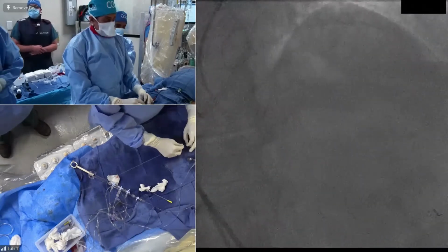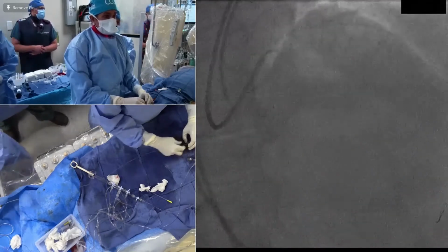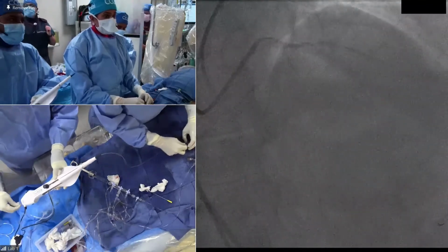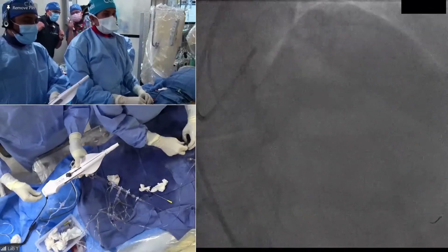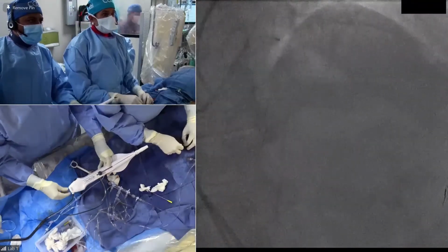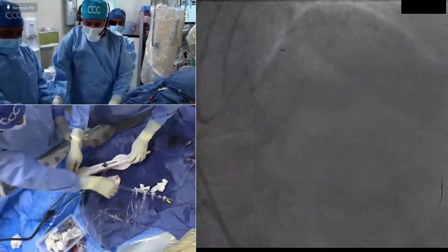Yeah. Right. Now, I mean, very clear, because for the CTO, you need a small burr to do a good job proximally, and for the bifurcation that everybody was so interested in, and to potentially even protect the side branch, you need a little bit of a bigger burr. And we actually have a 7 French guide. If need be, we can use a 2.0 burr proximally. Yeah. So you go 1.25, 1.75? Yeah. No, I would say if we are not going to the lesion, I think we have to.